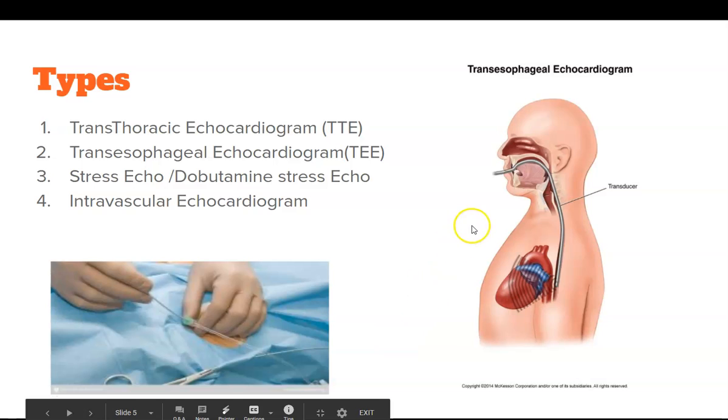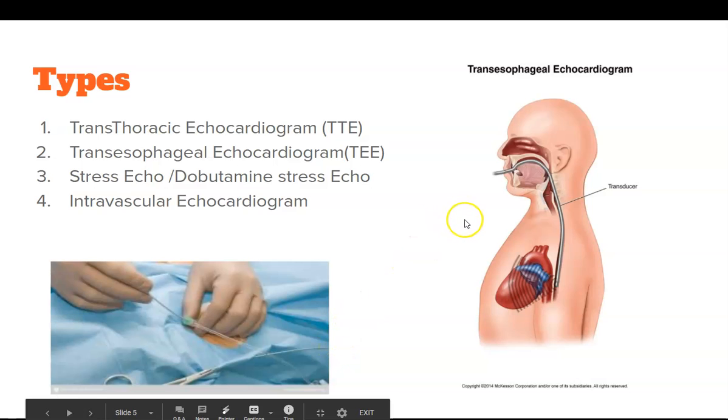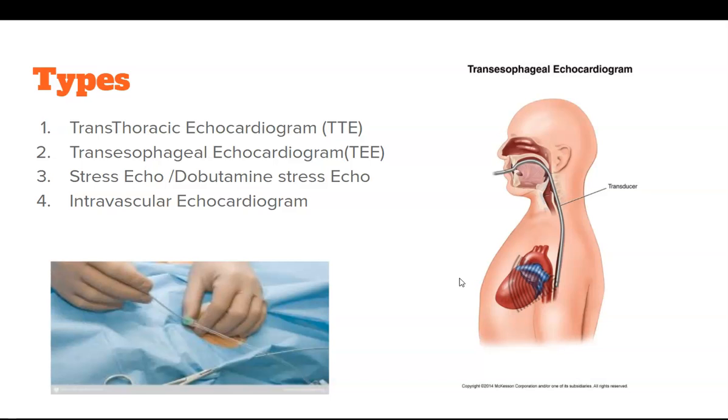So it goes into the superior vena cava and near that, the inferior vena cava, into the right atrium, so that they can visualize or scan the internal structure of the heart very clearly. So they will introduce a probe as a very small catheter into the vein, and it will reach the inferior vena cava and into the heart, that is the right atrium.